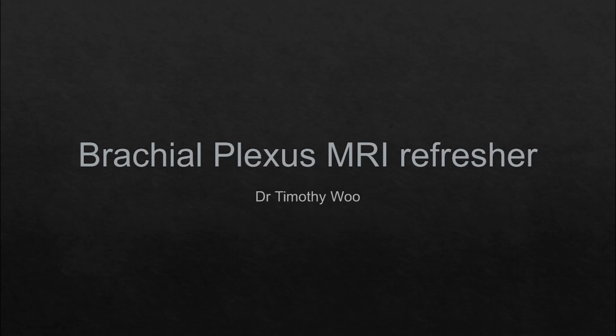So welcome everybody. This is my Brachial Plexus MRI lecture, and this is going to cover our current Brachial Plexus MRI protocol, the rationale behind each of the sequences that we have chosen, and the discussion of pathologies that affect the brachial plexus, which we often receive requests to be imaged. I'm going to go through the methodology I use to look through the scans in each case, and we'll finish with a few examples of pathology.